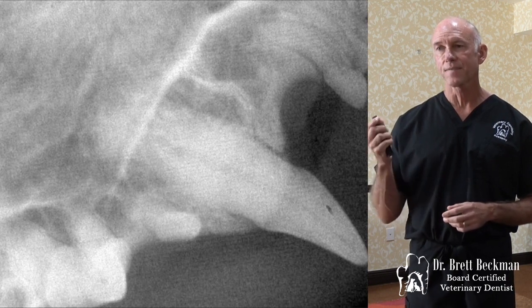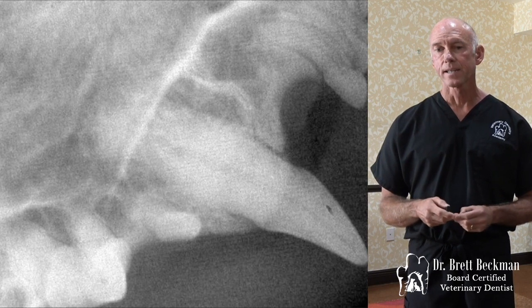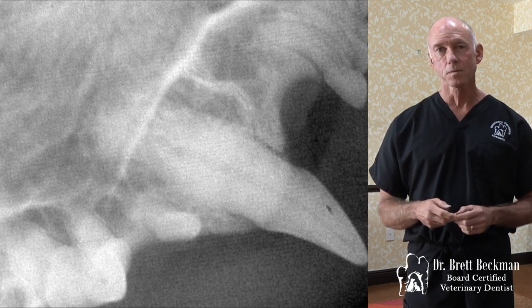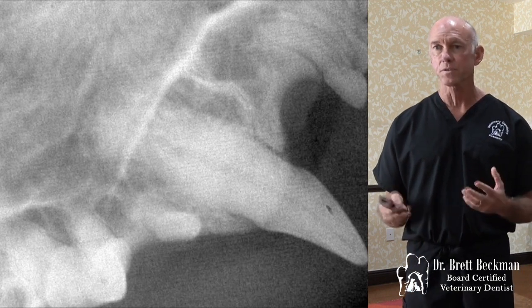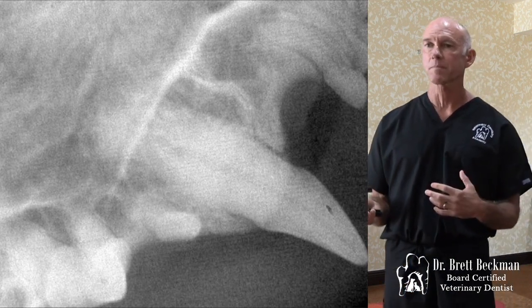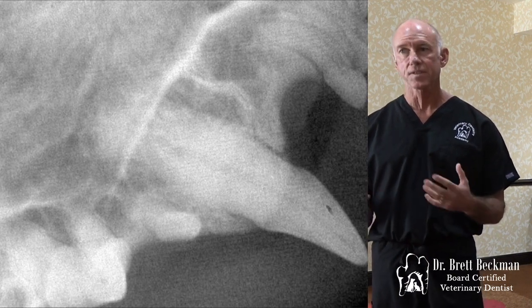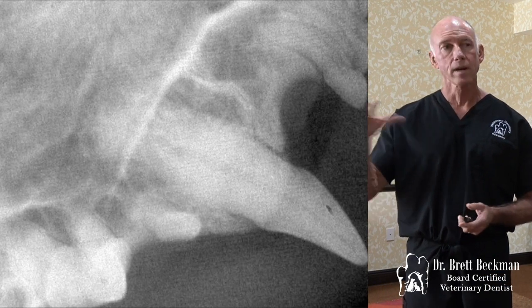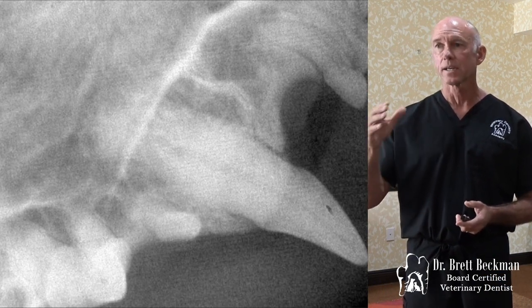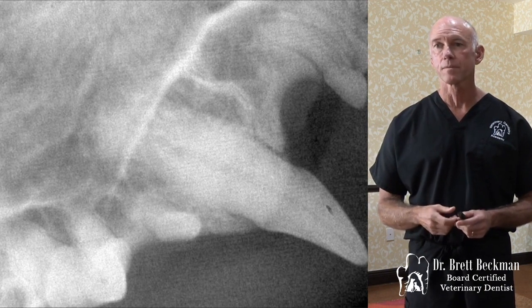Now, if this cat's 15 and he's healthy otherwise, and it's almost to the marginal bone level, then that's an extraction or a partial extraction, usually a partial extraction, because again, those are generally going to be type 2 resorption where you can't see a periodontal ligament space, and so you're going to remove the crown and whatever root has changes, and then you're going to suture over the top of that after you've smoothed it with your football burr.